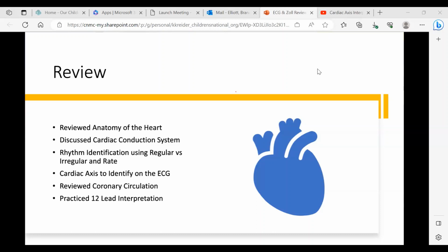Not to keep you, sorry, but what's your indication for doing 12 leads? Like a 6-year-old in the ER with chest pain. Anybody with chest pain can have a 12 lead. You can do 12 leads for anything you want, but don't do it on all your patients. No, kids pass out all the time for real dumb reasons. I'm talking about for adults. Oh yeah, they should do it. But also we had a patient they did nothing for. If they do a 12 lead in our ER, it gets taken and interpreted on the 12 lead machine before we even get there. And the doctor is like, oh, it's normal, and nobody looks at it.